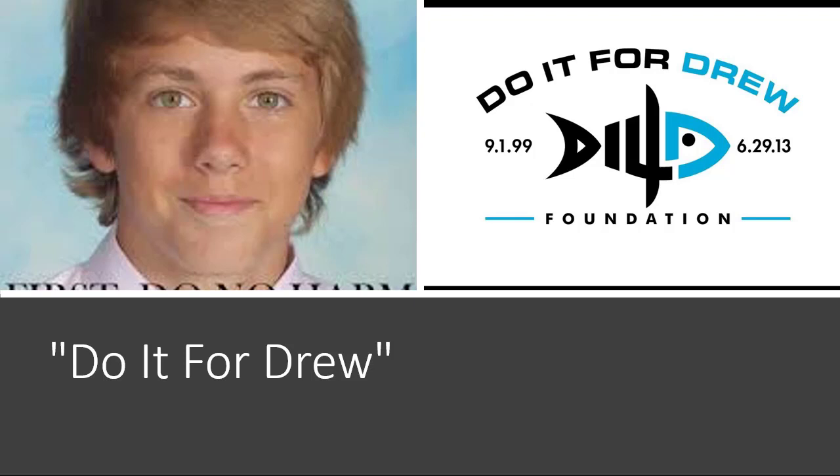They would have problem-solved the problem. They would have troubleshooted the problem. And Drew would be alive today. Unfortunately, by the time they got to the transferring facility, cardiac arrest in process and everything else, 30 minutes without end-tidal CO2, 30 minutes with a gut tube that nobody recognized.